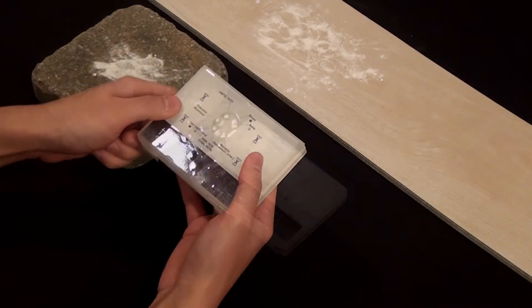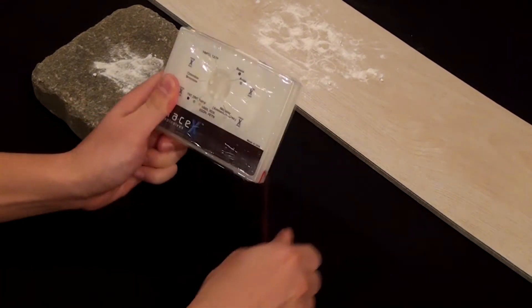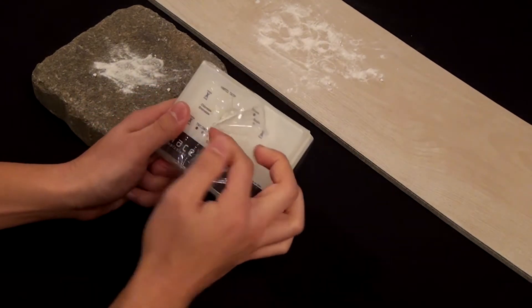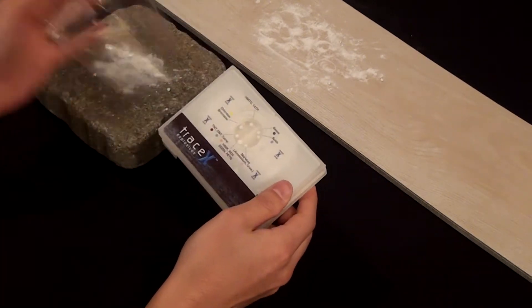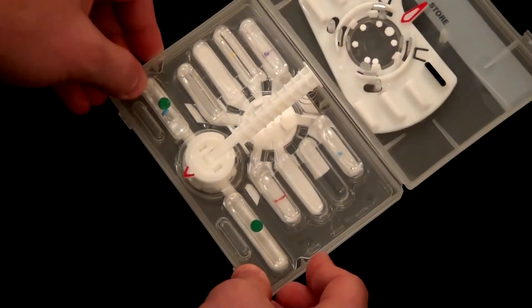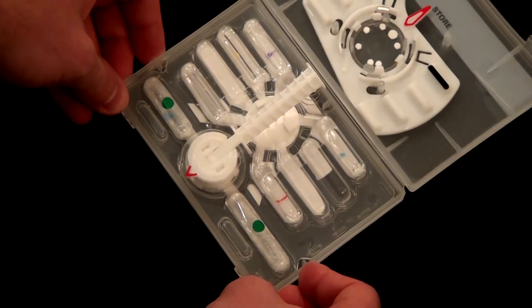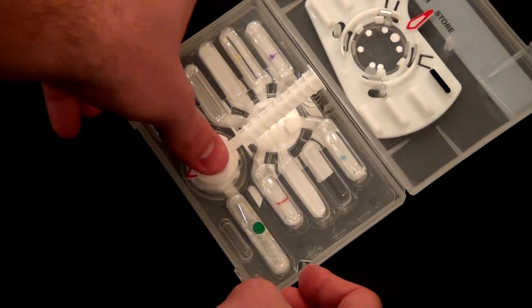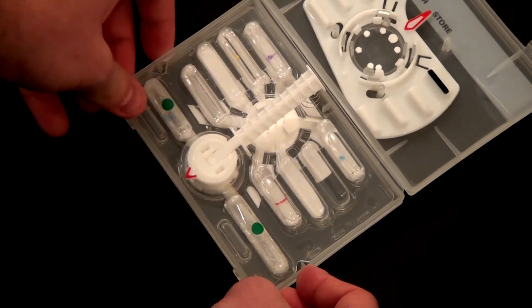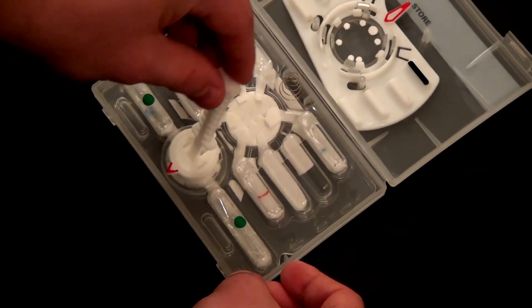Do not use the TRACE-X beyond the printed expiration date. Step 1: remove the kit from the bag. Open the case by gently pulling the latches forward and lifting the lid. Press down on the green dots to crush the wetting ampules, then wait 10 seconds. Step 2: press down and immediately release the collector to moisten the collector plugs.